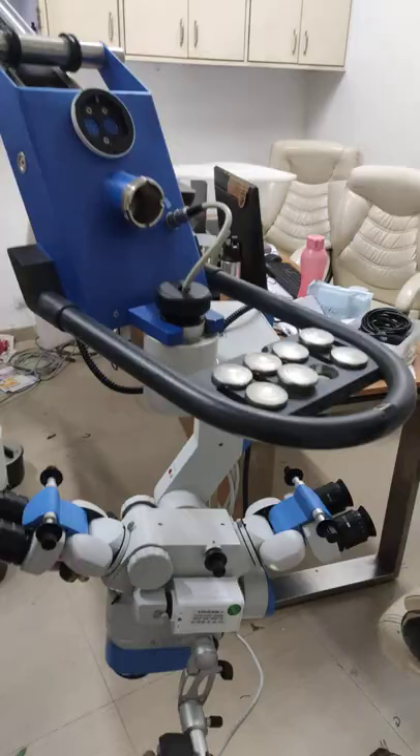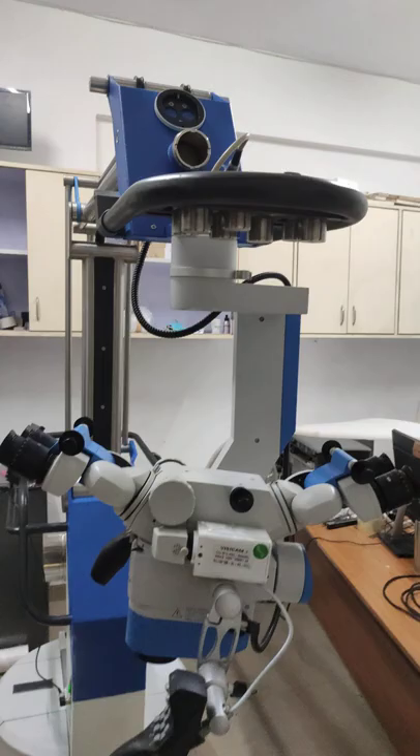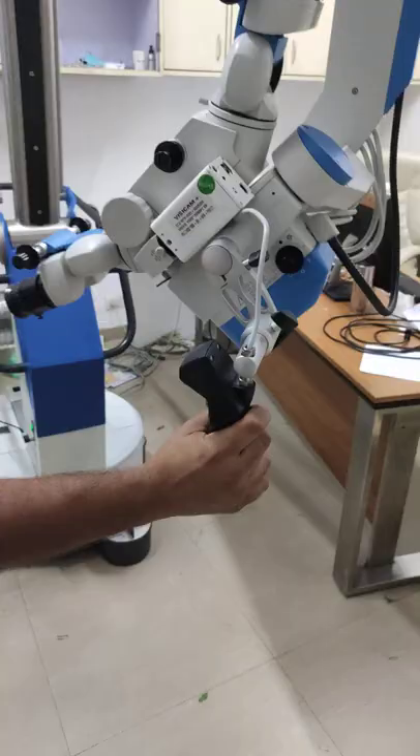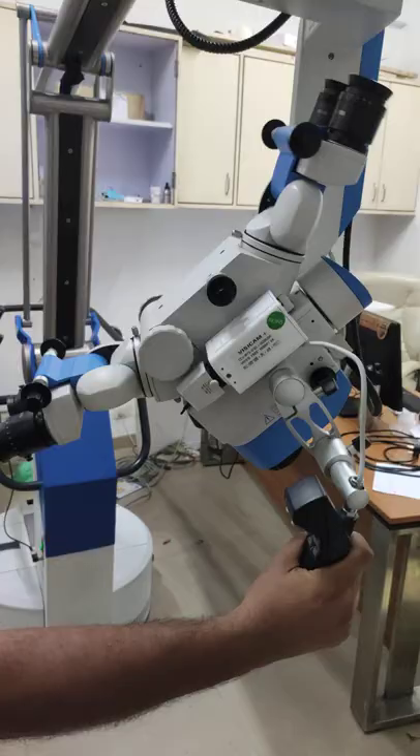You can see these rings — these are for auto-balancing. It has a special auto-balancing feature: you let it go and it will auto-balance on its own. With a single touch you can totally control it and focus wherever you want.